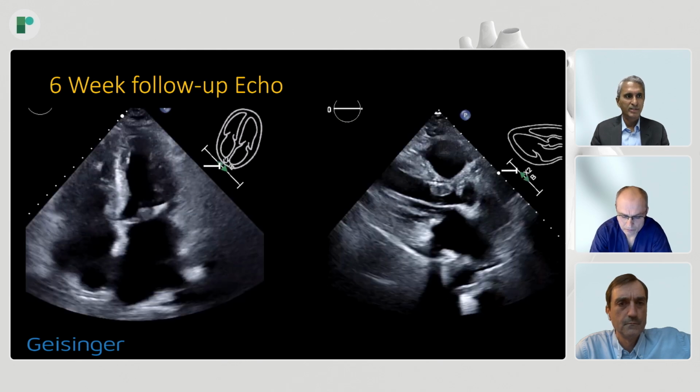And over a period of 6 weeks, it completely resolved. The interesting aspect of this was that the lead threshold didn't change at all. We still had good non-selective to selective capture, even at the end of the 6-week follow-up.